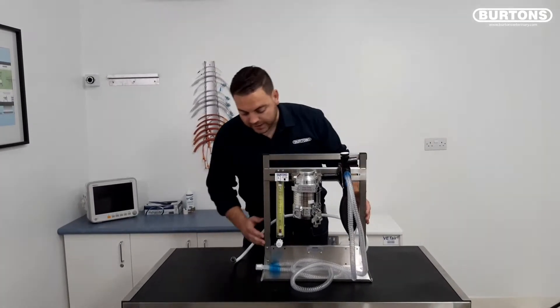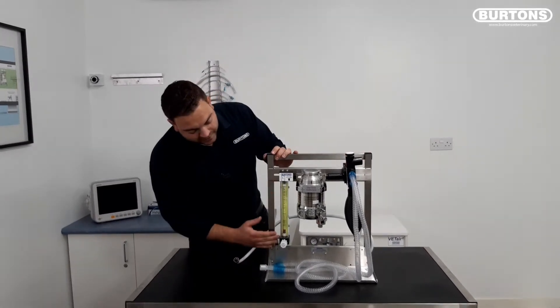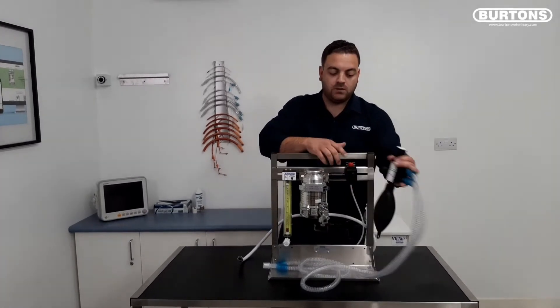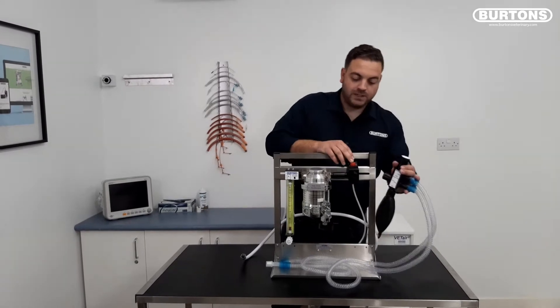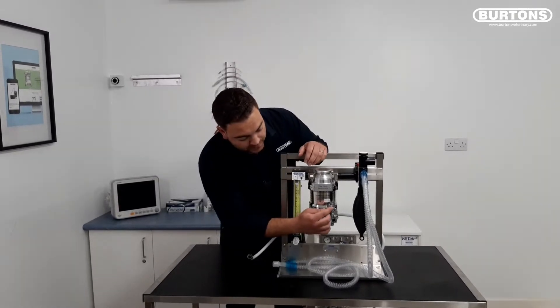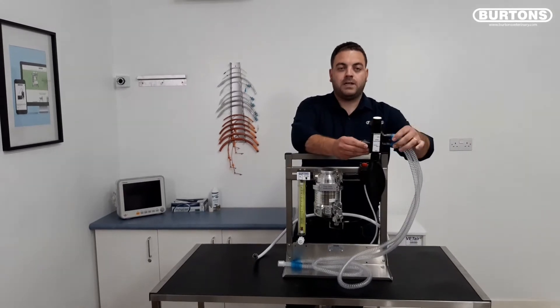The machine itself has an integrated shelf built into the frame, a high accuracy rotameter, and comes equipped with the vaporizer feed tube and also the corner O2 flush unit which does have a pressure release valve built in. This particular machine has been specced with the additional vaporizer which is key fill variety and also the Burtons mini lac system.